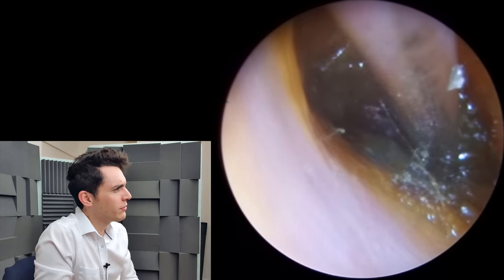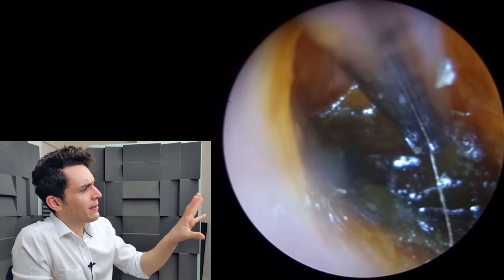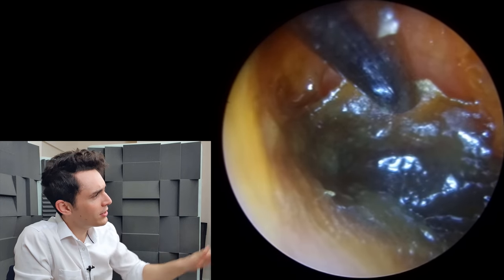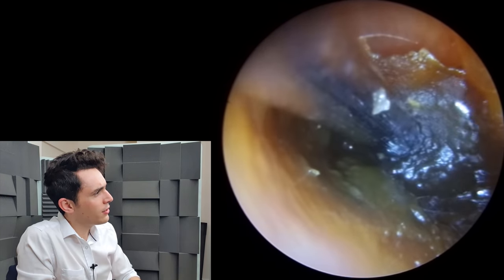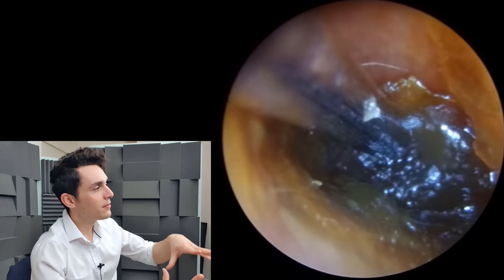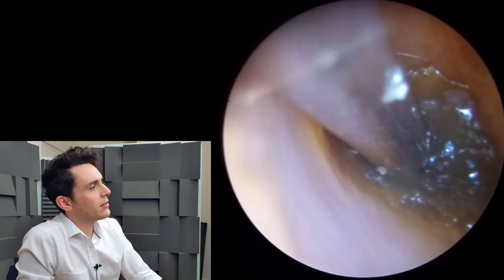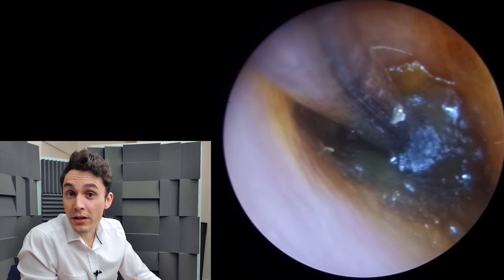This particular case was very difficult. We have a sort of encrusted mass of dead skin and wax very deep in the ear. As I push this mass — just see on the right hand side of the frame — as I push in, you'll see all this fluid emerging. So this mass isn't cemented, it isn't adhered to the eardrum, which is a good sign. I know that there's fluid behind it, but it was an extremely difficult case.